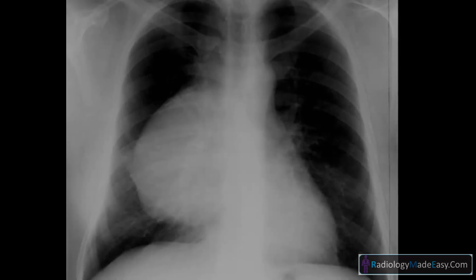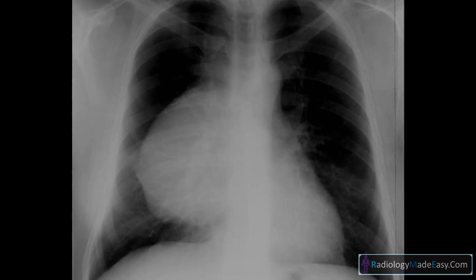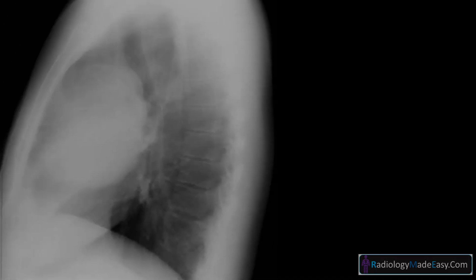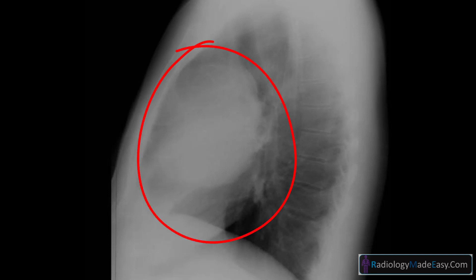On this frontal chest X-ray, you can see an obvious right-sided mass. When we look at the lateral radiograph, we can see the mass is anterior. Therefore, this is an anterior mediastinal mass.